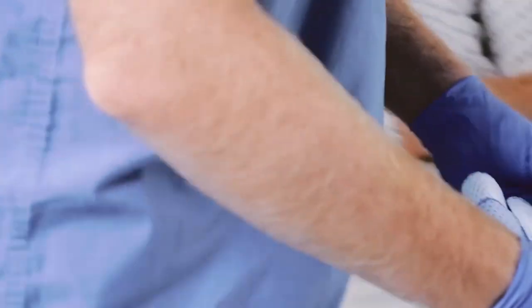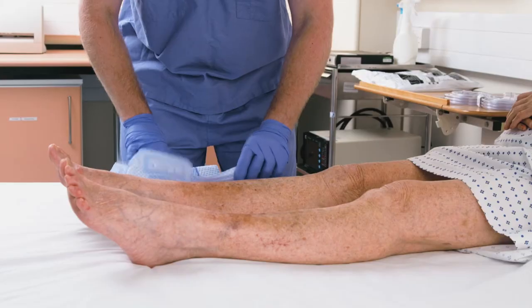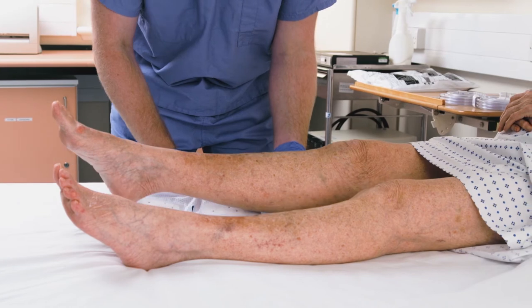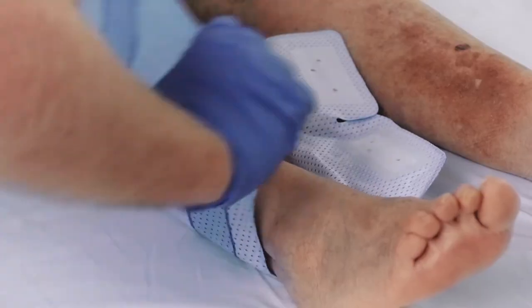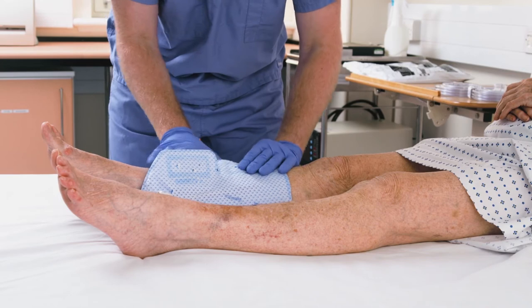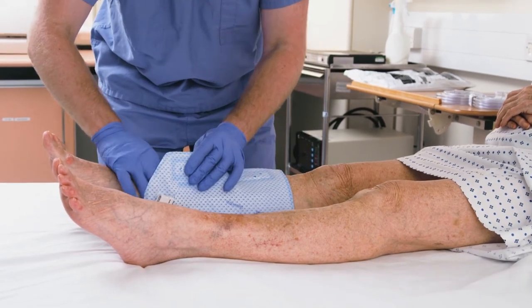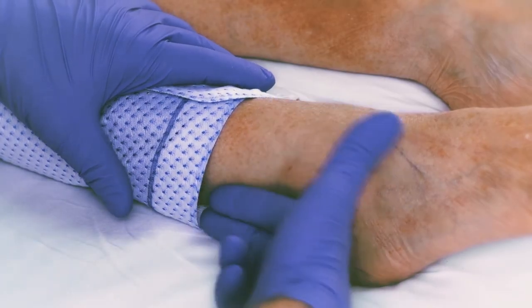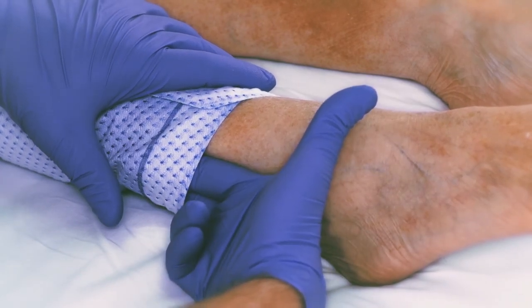To place the knee length sleeve, orientate it with the back of the patient's leg, then wrap the sleeve around the leg, fastening the Velcro closure tabs. Make sure to leave approximately two fingers of space between the deflated sleeve and the patient's leg.